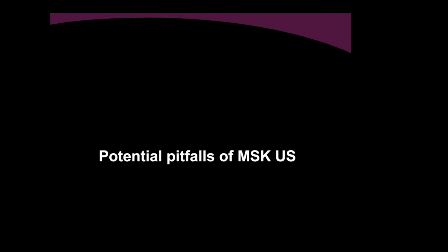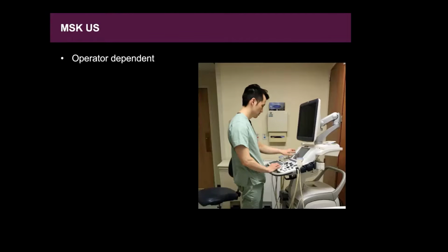So, some of the potential pitfalls of MSK ultrasound. It is operator dependent. I'm sure you are all aware that there are people who are very good at it and people who need a little bit more practice. So it's just something that you have to be aware of: all the potential pitfalls, and be comfortable with the modality or be comfortable with who's doing it for you.